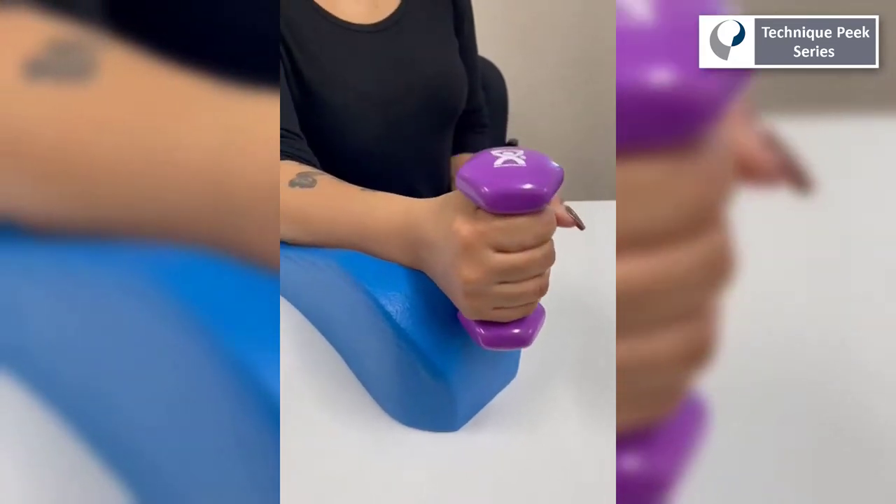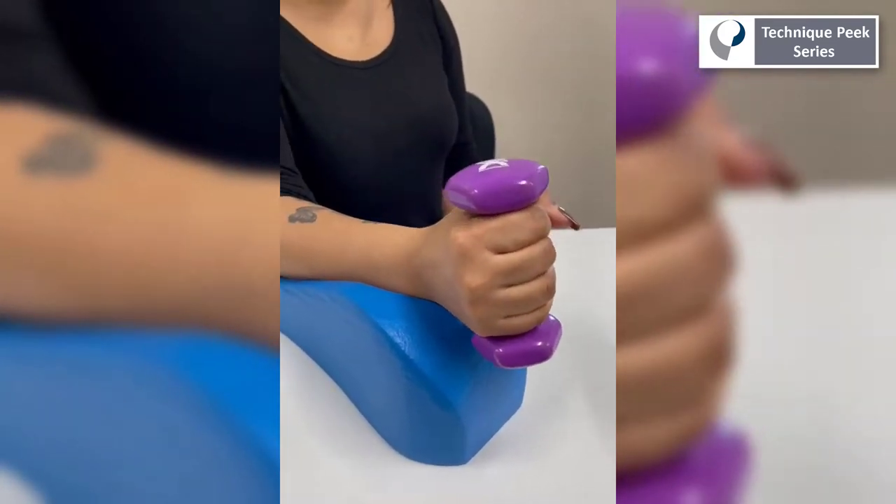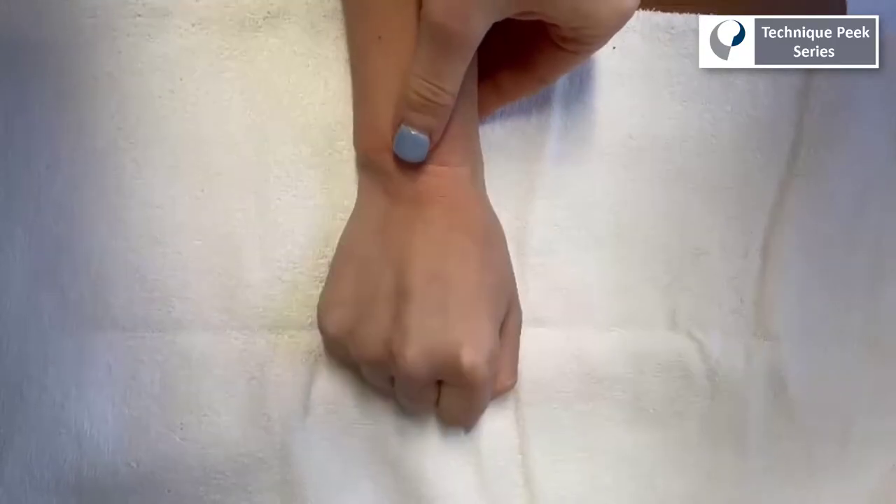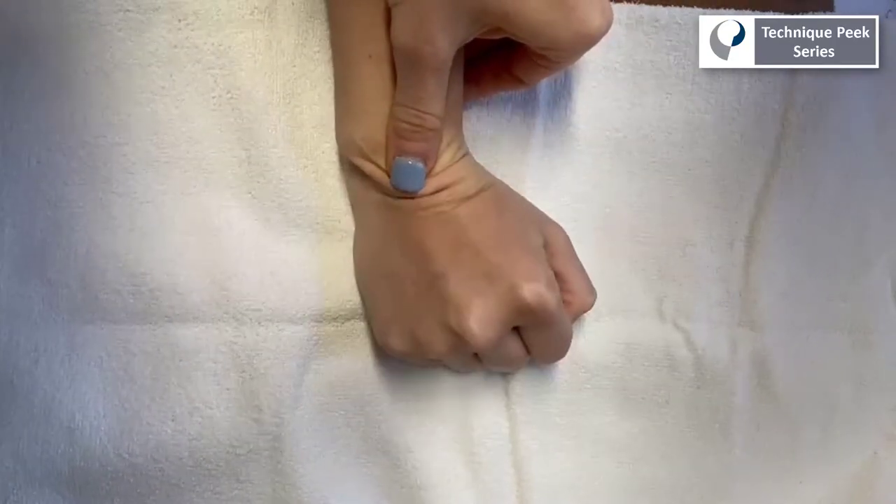First, we want to have the patient indicate where they are feeling pain and with what movement it is worse. In this instance, the patient has increased pain of the wrist with radial deviation.